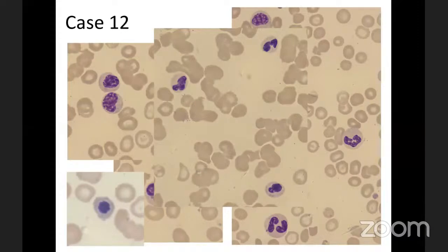So an adult patient of 60 and more age, persistent pancytopenia, dysplastic change in the granulocytic cells, the neutrophils, and the available nucleated RBCs. So you need to make sure that these dysplastic changes are more than 10% of the available lineage, and definitely in this case, it's more than 10% in the peripheral blood. However, you need to do your bone marrow.